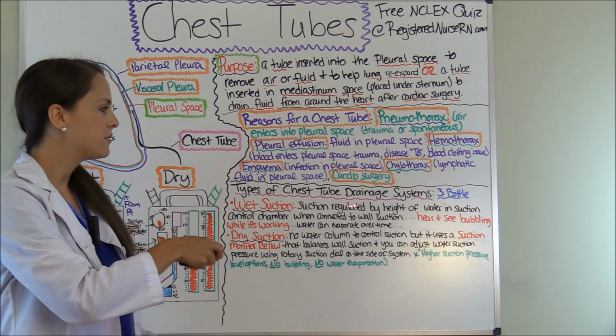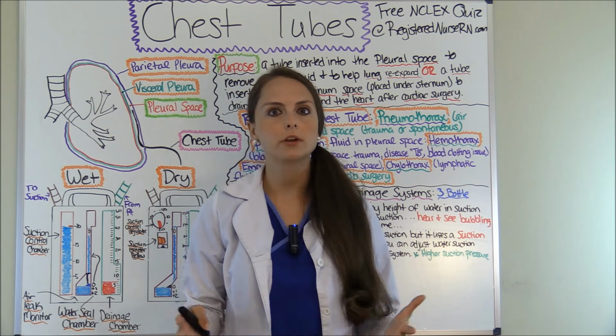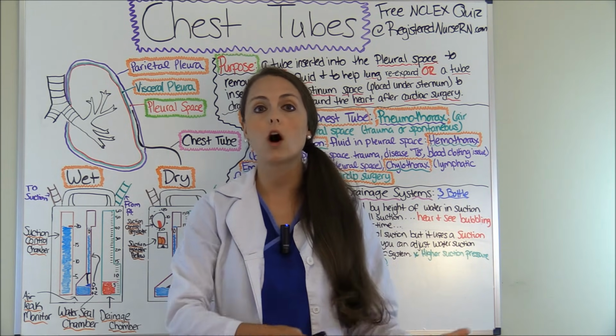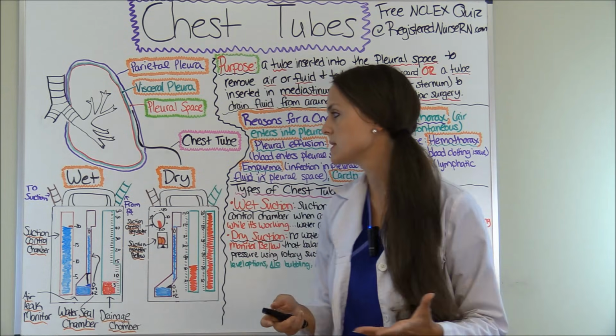Now let's look at the different types of chest tube drainage systems. Whenever you get a job as a nurse, be sure to familiarize yourself with the different types of chest tube drainage systems your facility offers, and make sure you get a good in-service on that because different places have different chest tube drainage systems.